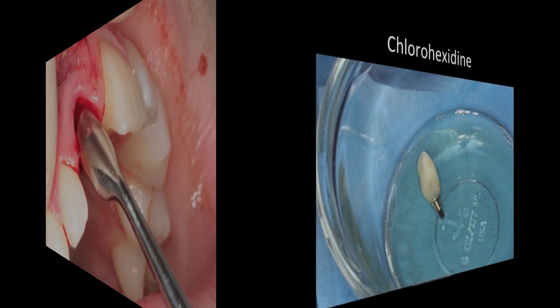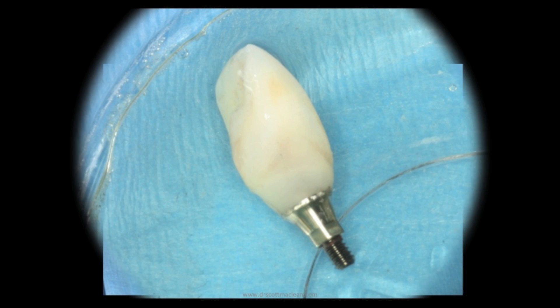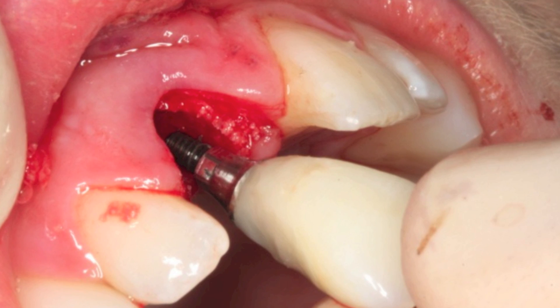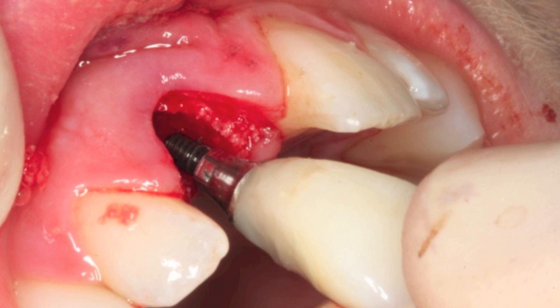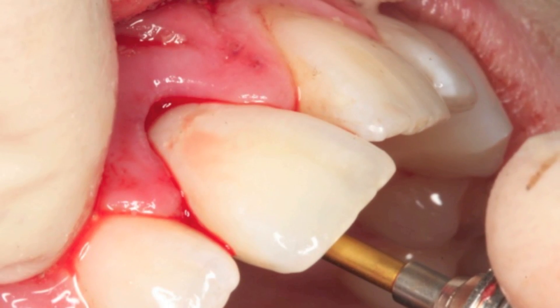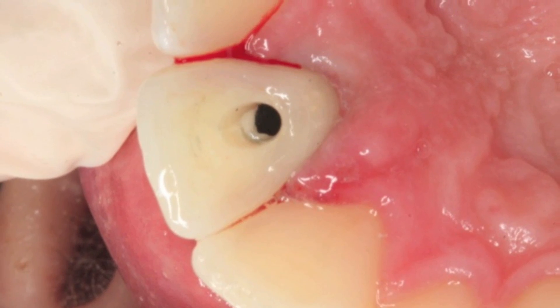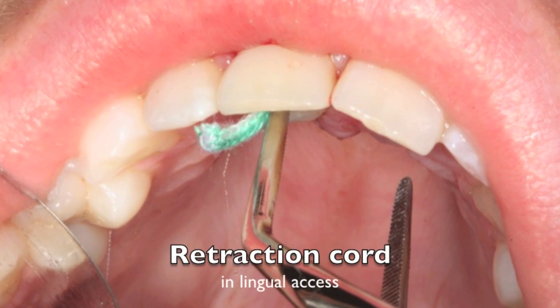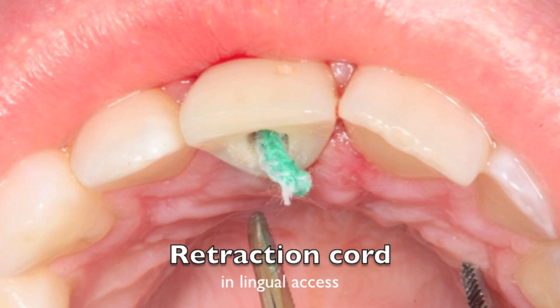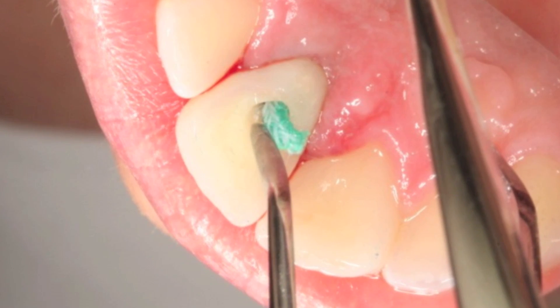I'll always put the temporary in chlorhexidine because I'm passing it into an open wound and I want it to be as clean as possible when it's seated — this is important to healing. We take off the healing abutment, which has gone to the outside of the platform, creating a nice channel to go inside to the platform. Using the platform shift, the bone graft goes in and makes a nice seal, and then the temporary goes around this, which also seals the soft tissue. We're getting an early healing response because the zone of attachment is still looking for somewhere to heal — it's going to try to heal against this new tooth and temporary. By doing minimum preparation to the tissues and minimum trauma, we're able to get the body to really like it.